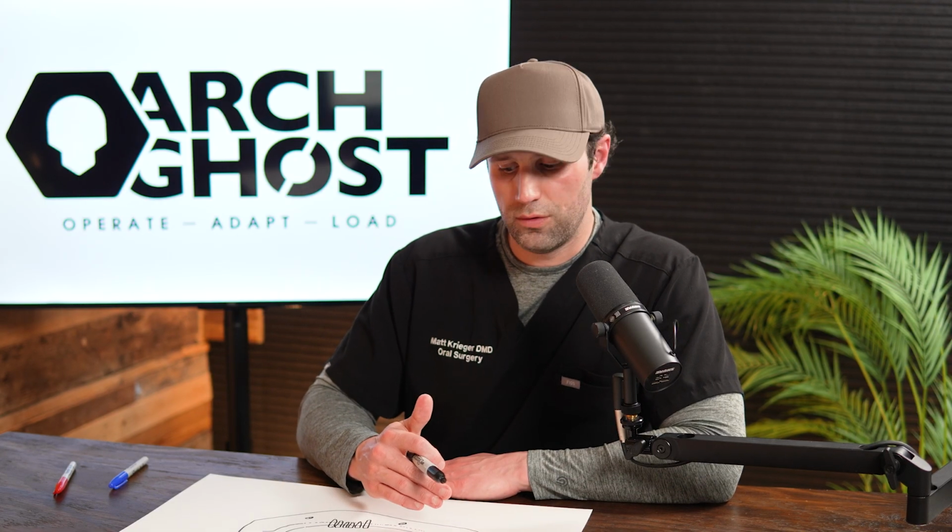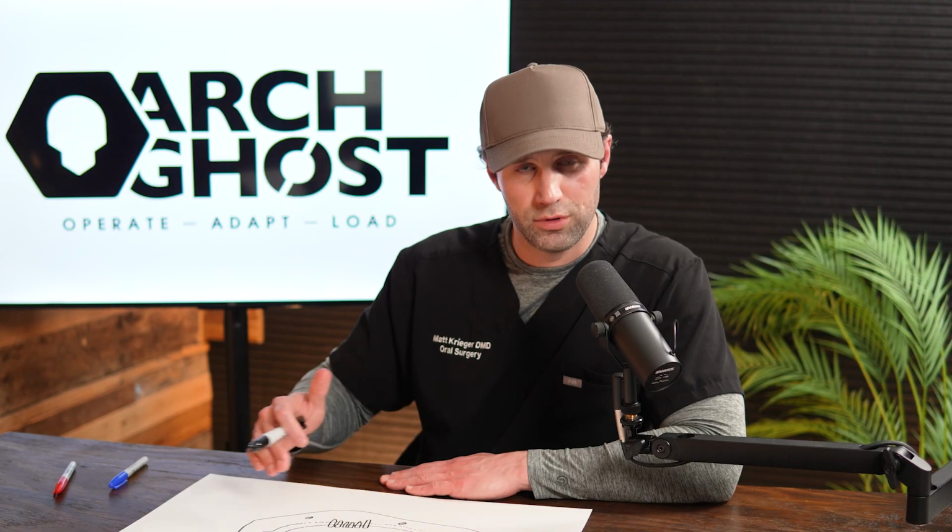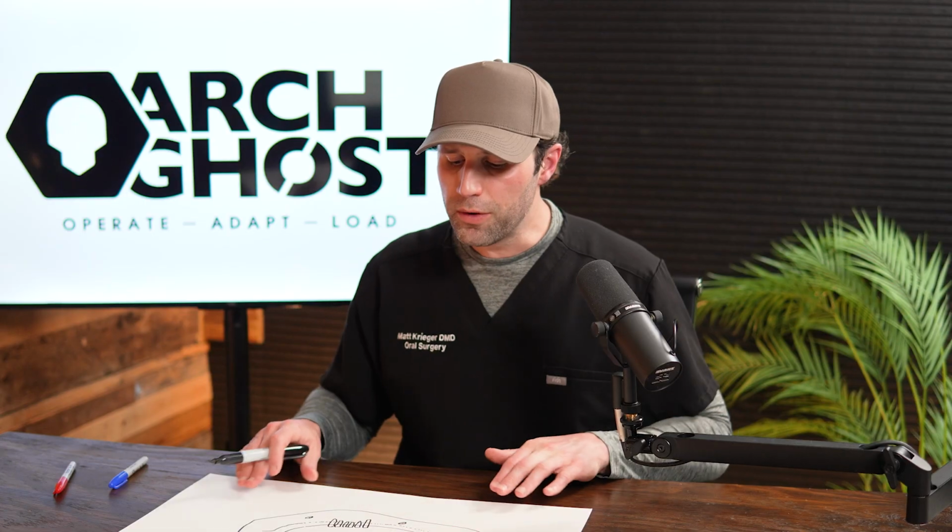I'm not saying that this should be the only thing that you use. You should be performing actual measurements intraoperatively. But this is, again, something that you can just get a quick reference point, understanding where you're at. Are you way below that point? Did you over-reduce? Are you planning your initial reduction line way above that point? It's probably going to be insufficient. So again, just a reference point for a quick visual assessment.